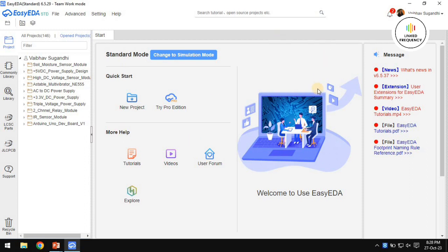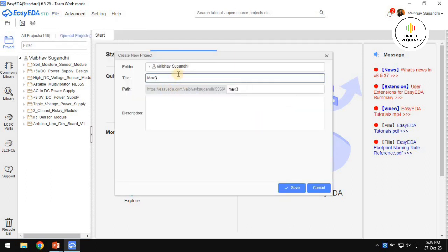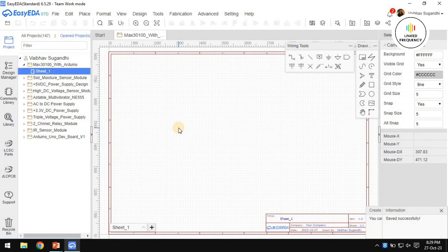First thing is, I am on the EasyEDA, log in to your account and start with the design activity. First, I will go to File, click on New and create a new project. MAX30100 with Arduino. I'll click on save and now I will start designing the circuit as we do, in a fast forward way.